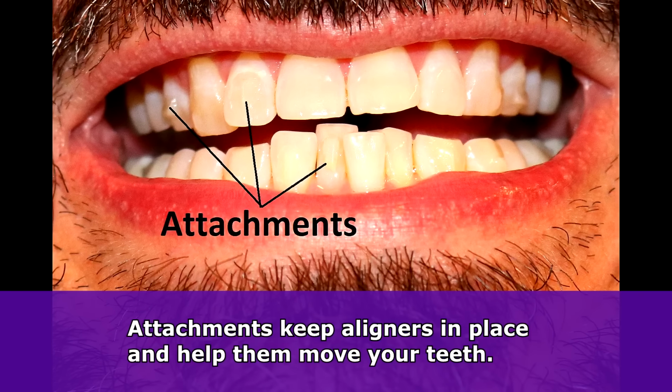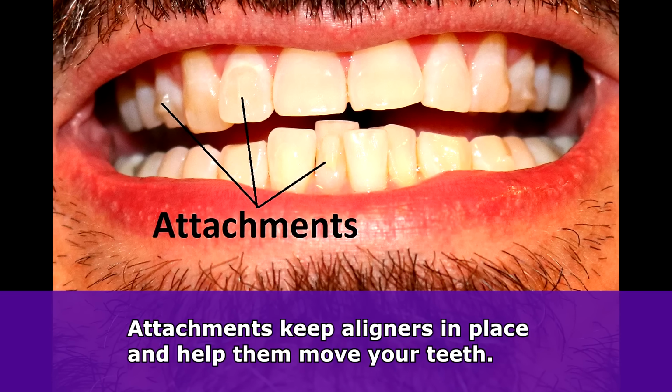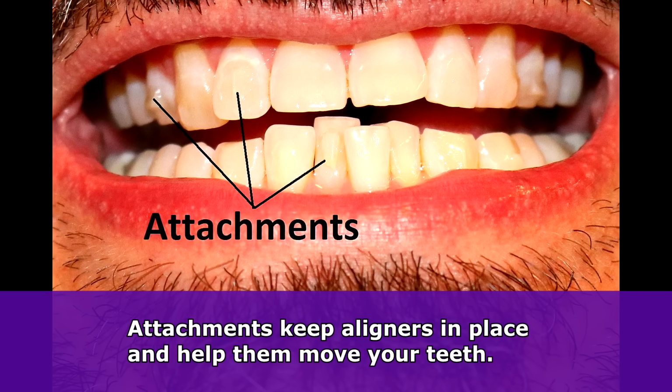Now, whenever you do orthodontic treatment with clear aligners, a lot of times they will apply something called attachments, and that's basically these little knob things you see here on my teeth. And they actually placed those attachments on my teeth during my first appointment when I got my aligners. It only took them a few minutes and didn't hurt at all. However, removing your aligners can be a bit tricky when you have a lot of those attachments on your teeth.